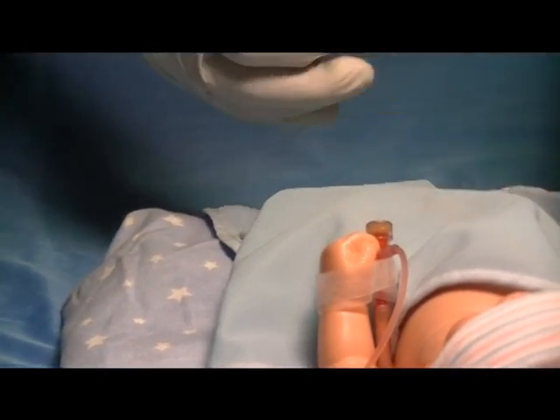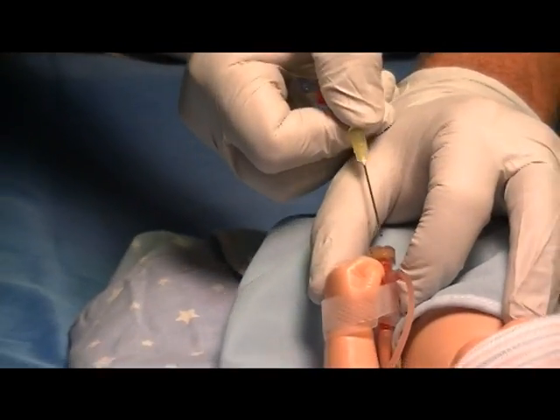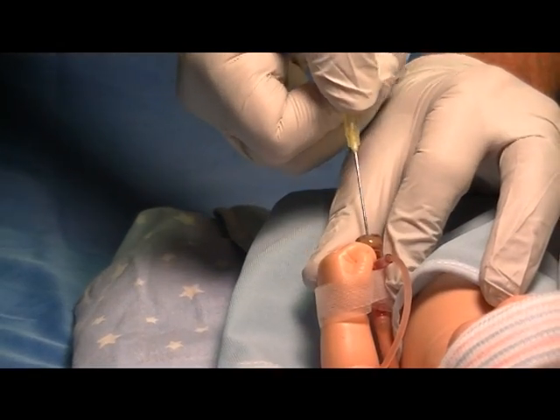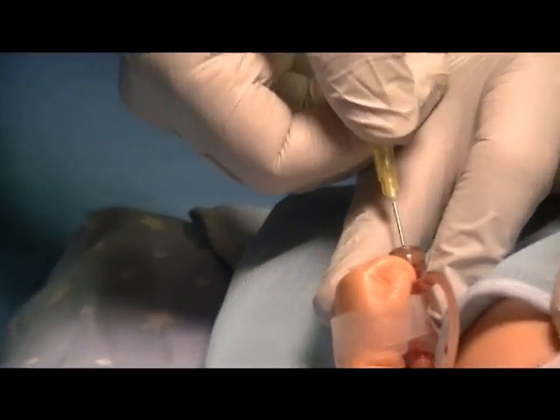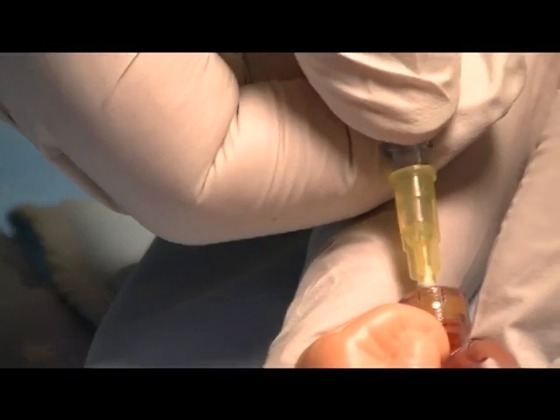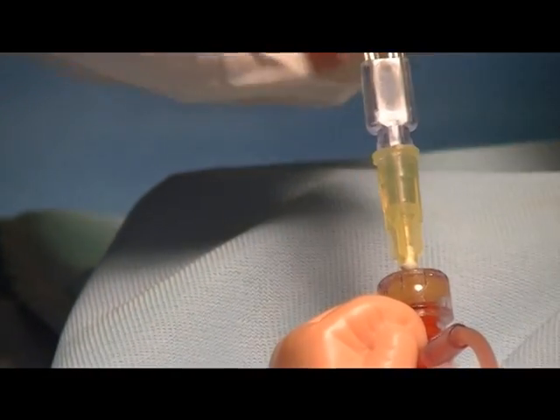You would remove the sterility cover from the Humi and go to the split septum T-connector and insert at a 90 degree angle until it's fully seated inside the catheter hub.